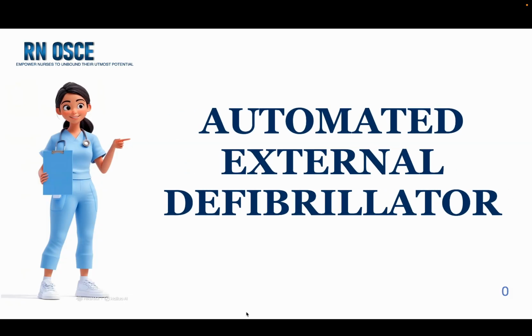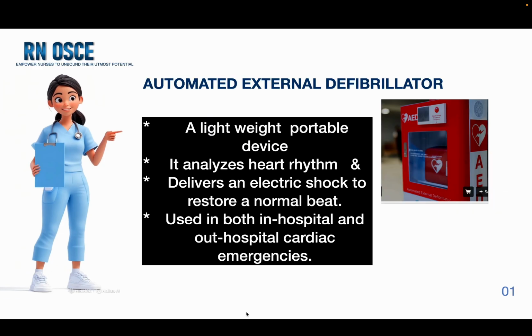Today we will be discussing AED, Automated External Defibrillator, in detail. An automated external defibrillator is a lightweight portable device. It analyzes the heart rhythm and delivers an electric shock to help restore a normal heartbeat. It can be used in both in-hospital and out-of-hospital cardiac emergencies.